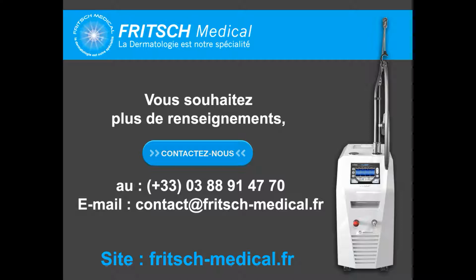But if you combine in the same session with the 1064, you try to modify also the texture of the skin. So you induce a neocollagenesis. But you combine the both in the same session. I prefer to combine in the same session, it takes less time, than to make the choice: the first session KTP, the second session 1064.